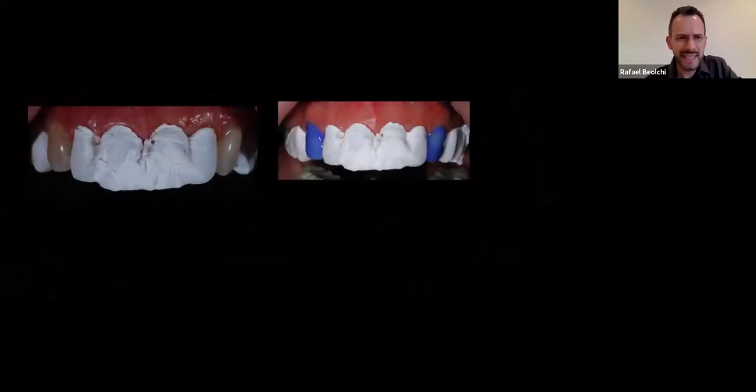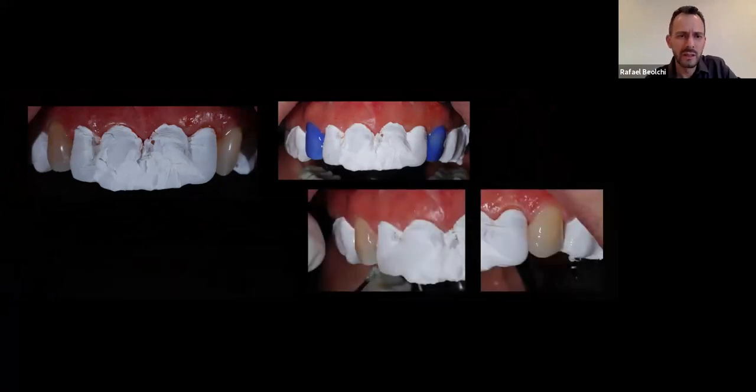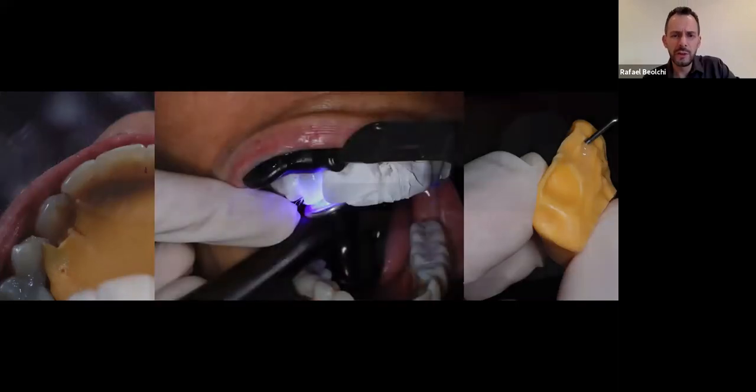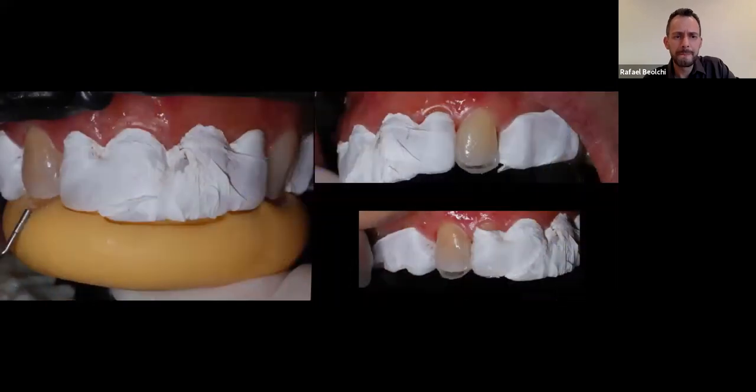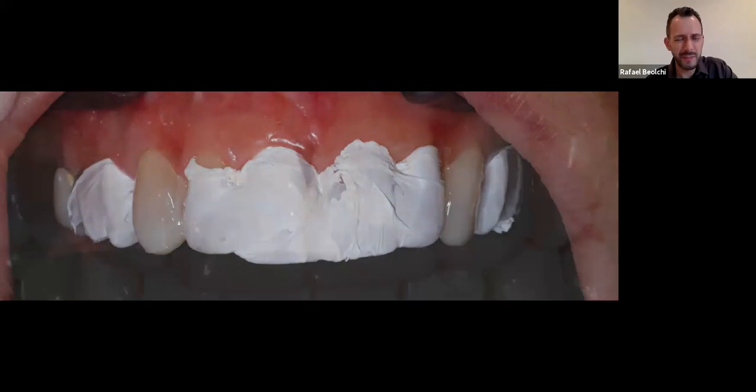Canines again, guys, the same thing: etching, washing, drying, bonding, and applying. The only difference is that the palatal was very thick to give us the canine guidance, lateral guidance. It should be very thick. And this is a good thing about the canine, because it supports it, so there's absolutely no problem. I did it in 2 steps. This is the only difference here: curing each step of the way, doing the palatal, and then going for the buccal, all the same color scheme.